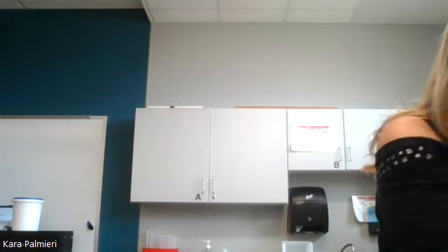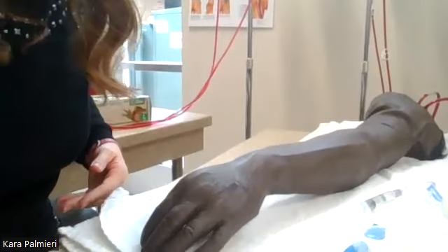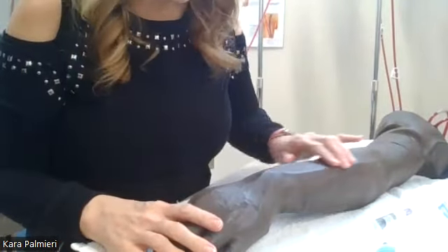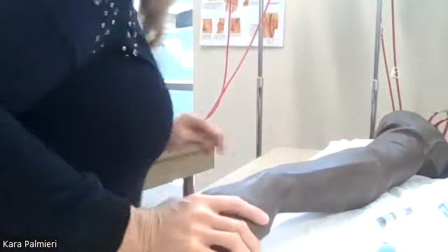Okay. Now, the only trouble I'm going to have is having to move things. I'm just moving things around so that when I move my camera, you can see that everything's out of the way. All right, so the next thing I'm going to do is turn this and angle it so you can see what I'm doing. This mannequin has wonderful ropey veins. You could take your pick on which one of these you want to use.